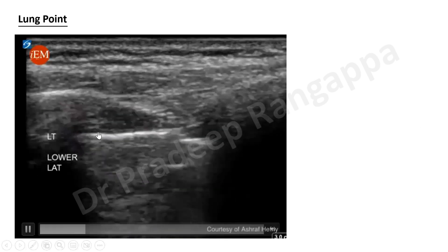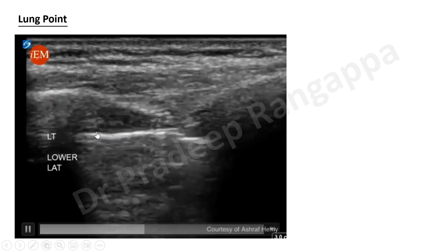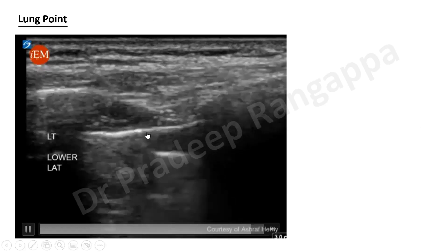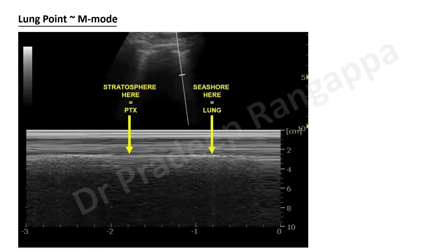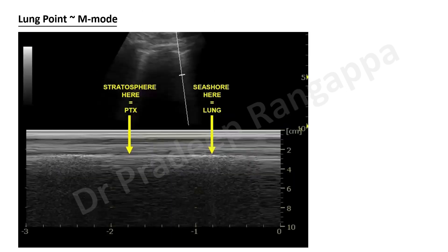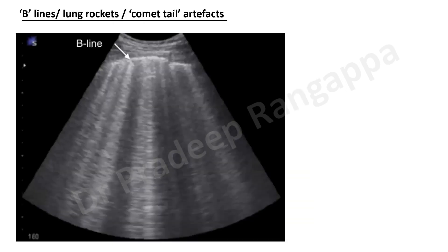Then there's something called the lung point. In this video, you can see lung sliding here — but no sliding there — indicating a transition from normal lung to a pneumothorax air pocket. When you put M-mode at the lung point, you see an alternating seashore sign and stratosphere sign. A large pneumothorax shows uniformly stratosphere sign, but the lung point — with alternating patterns — indicates a small or loculated pneumothorax.